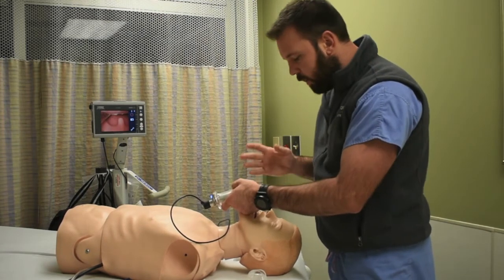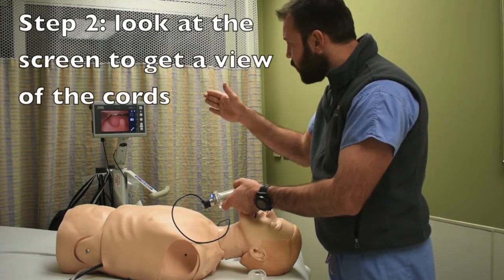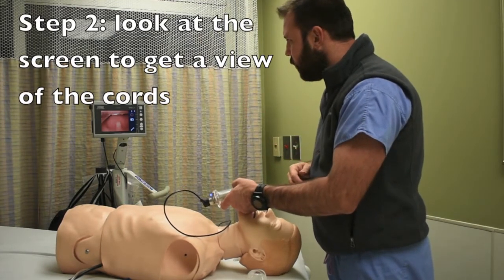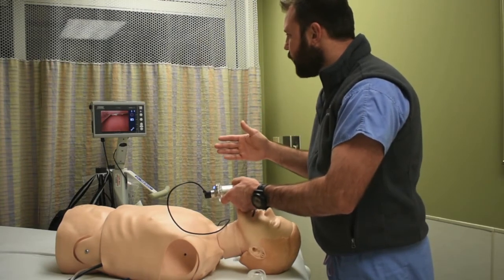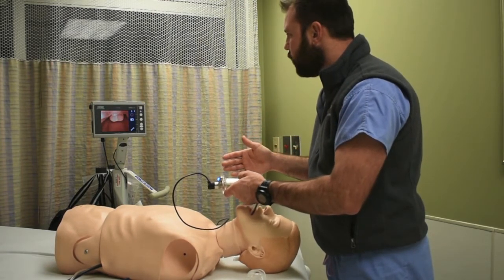Once you're past the tongue, transition to step 2, which is to move your view to the screen. We have little reason to look down into the airway at this point. Identifying airway structures, navigate a view of the glottis.